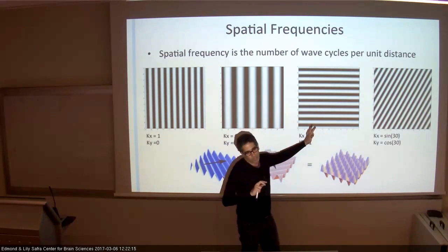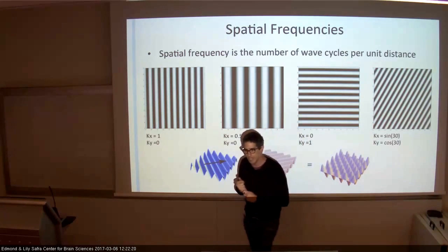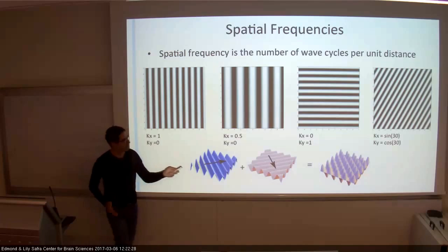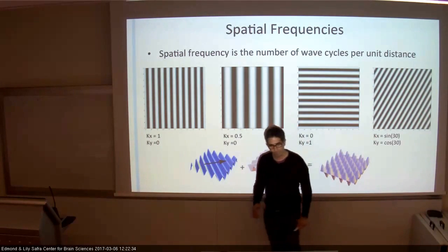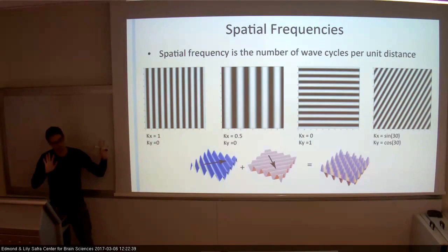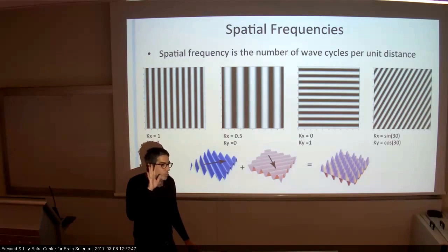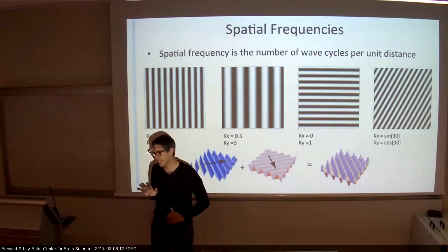Leave that for now. I'm just talking about some waveform in space, and it could have an orientation. It's just a combination of some waveform in X and in Y, and so in here it's this sine and cosine, and I get some kind of orientation in space. So the signal is the current that you measure with the coil, and this is what you keep. Wait, don't run to the MR interpretation of that. I just made one move here. I just said that as we can speak about frequencies, we can also talk about this waveform in space. Just that.